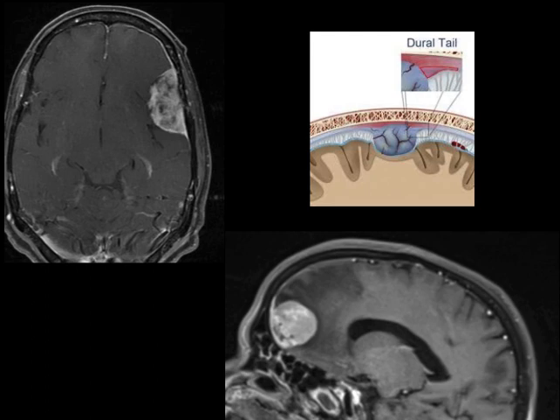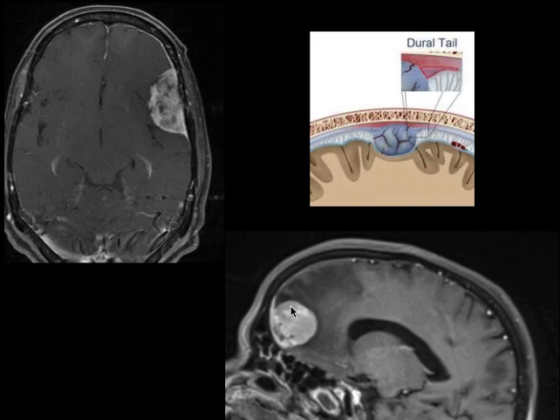These two are the cases of classic meningioma. You can see the extra-axial lesion, you can see the thickening and enhancement of the adjacent dura anteriorly and posteriorly along the left frontal convexity — classic appearance of meningioma with dural tail sign. This is another case of frontal meningioma. You can see the adjacent thickening and enhancement of the dura in a classic case of meningioma.